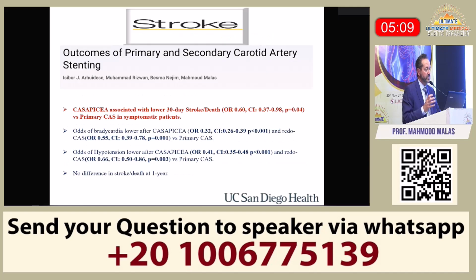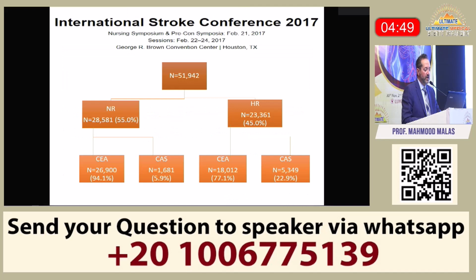So I would say restenosis is probably one area where stenting has benefit. And as a matter of fact, stenting has the safest outcome in restenosis because a lot of the time it's intimal hyperplasia, and patients don't get the same hemodynamic instability and they have a lot less risk of stroke.